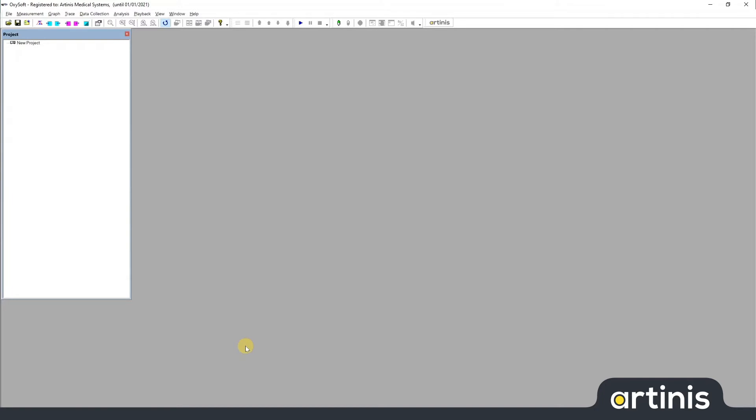Hi, I'm Christopher from Artinis Medical Systems. In this video I will talk about how project files and measurement files work in OxySoft. As you may know, OxySoft is organized by projects. In each project you can have multiple measurements, each measurement in turn containing graphs and traces actually displaying your data.